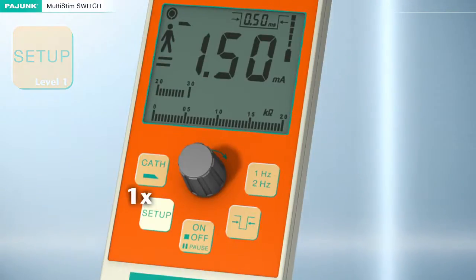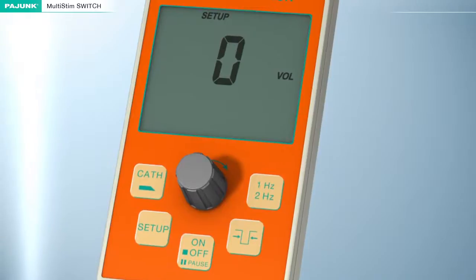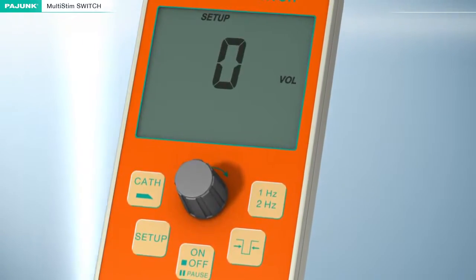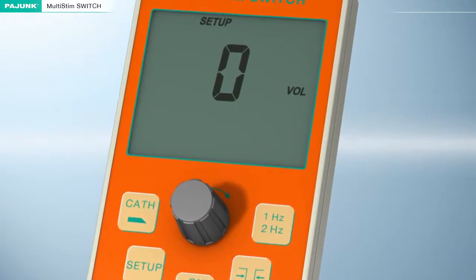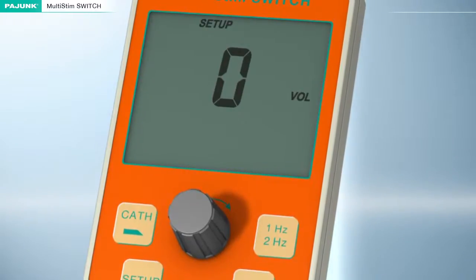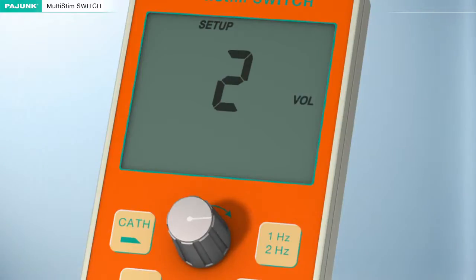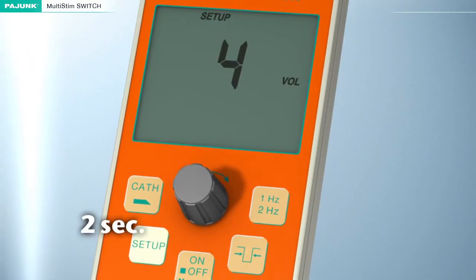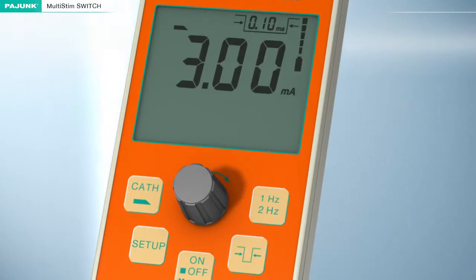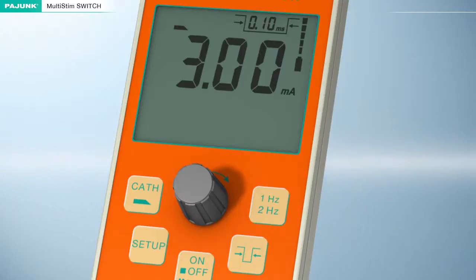Setup. Various program options can be defined by pressing the Setup button. Setup level 1: the volume of the warning and monitoring sounds can be adjusted in level 1. The scale ranges from 0, where monitoring and warning sounds are turned off, to 4, which is very loud. The adjustment of the volume is carried out by turning this knob. The Setup button must be pressed for at least 2 seconds to store the selected value permanently. A monitoring sound will be emitted upon successful storage, then the device will switch to pause mode automatically.